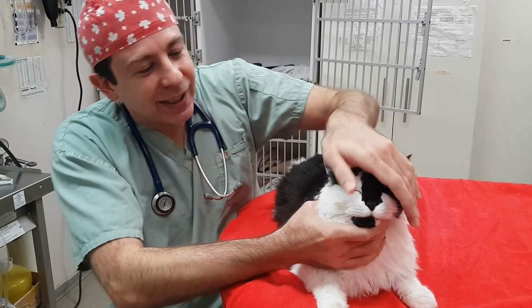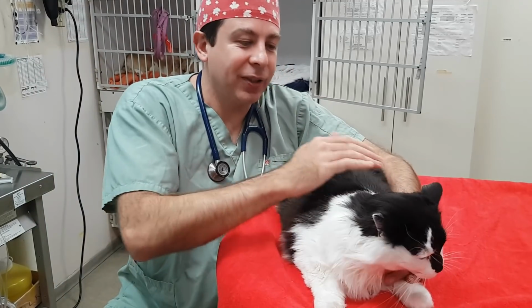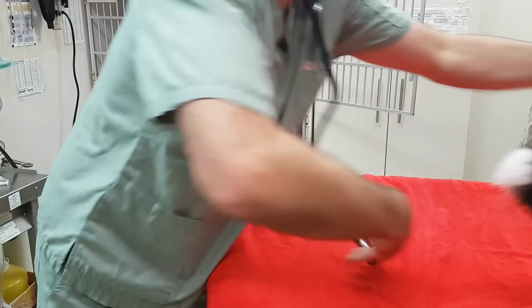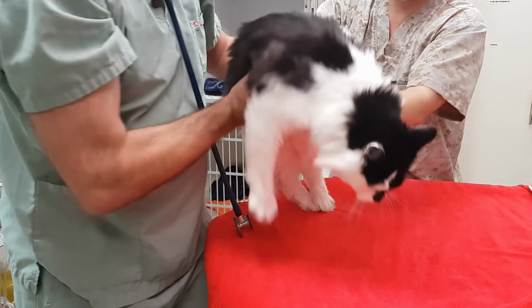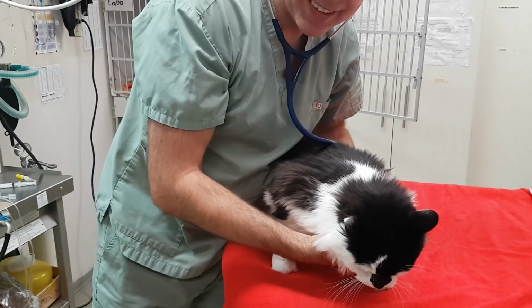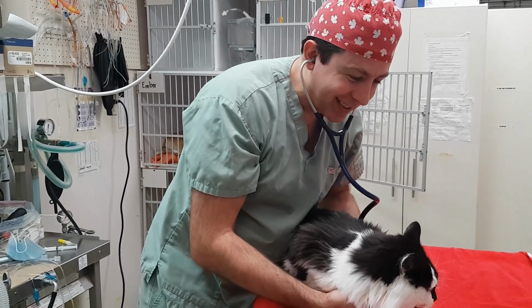So, quick exam. Just having a look at the gums, make sure they're perfusing well. Gotta listen to his heart. Gotta catch him. Thank you, sir. And this is a fine demonstration of the differences between being a veterinarian and a human physician.